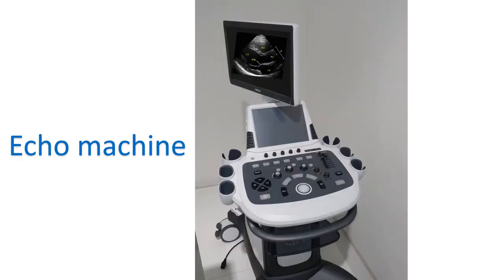Echo test is usually done with the subject slightly turned to the left side so that the heart becomes closer to the chest wall. Most of the interpretations are done by visualizing the live images, while some may require close scrutiny of frozen images. Both still images and cine loops may be stored in the machine for future retrieval.